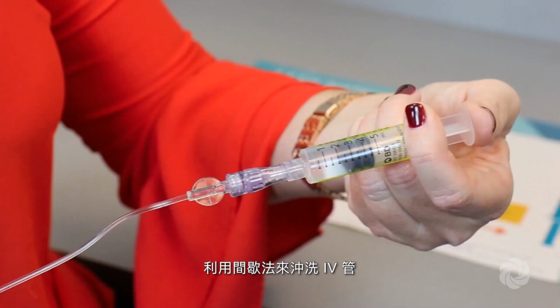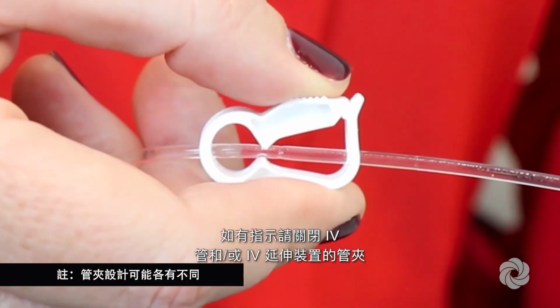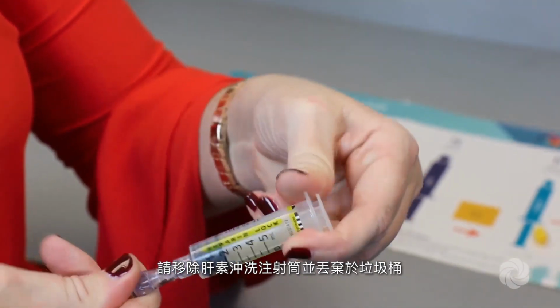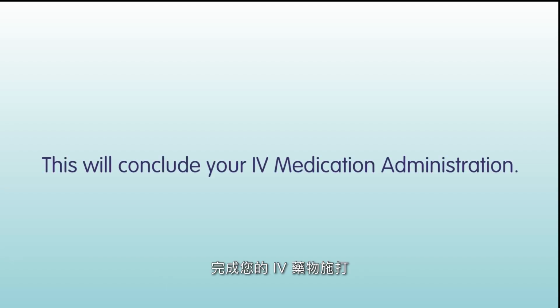Flush your IV catheter using a push-pause method. Close the clamp on your IV catheter and/or extension set if indicated. Lastly, remove and discard the heparin flush syringe in a trash container, thus concluding your IV medication administration.